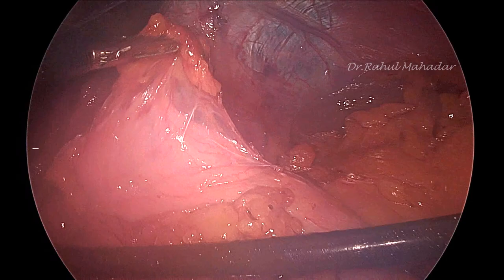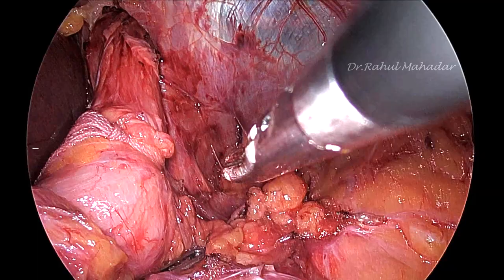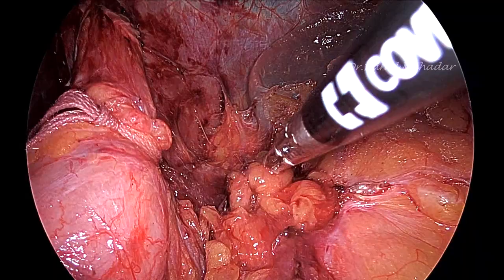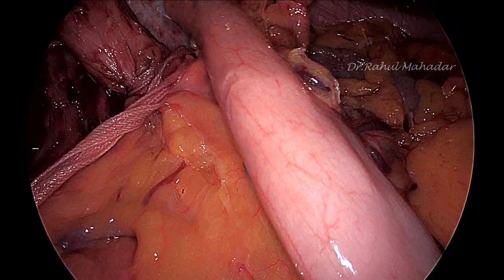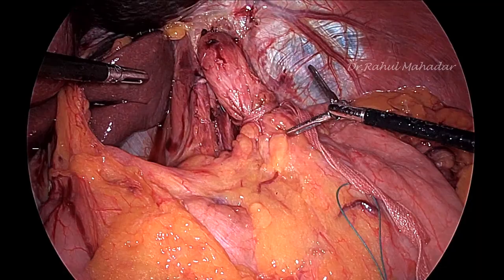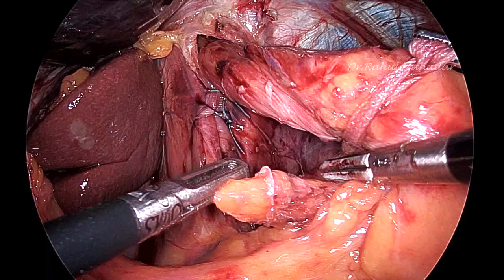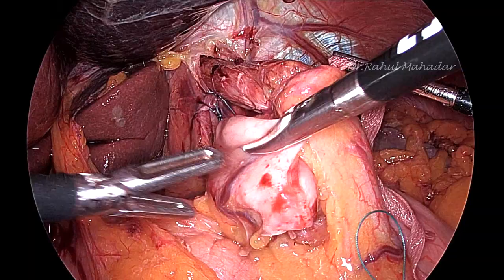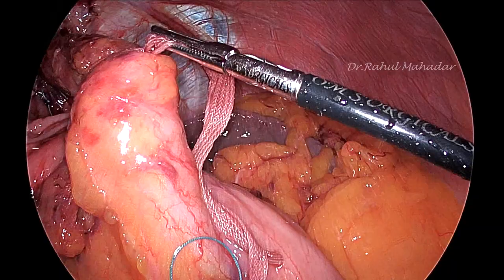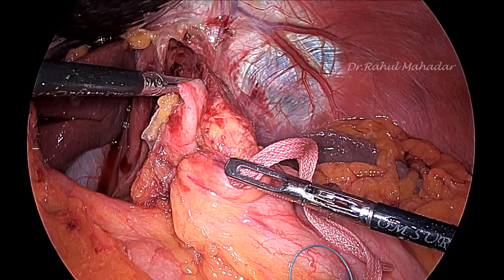Can see here and appreciate. You can appreciate that the splenic artery is well maintained. Now you can see here the splenic artery. Now ask the assistant to catch hold of this traction around OG junction, and you can see now it is not going back. So now we can take a 360 degree wrap around OG junction.